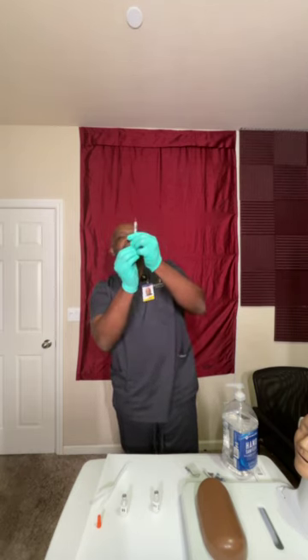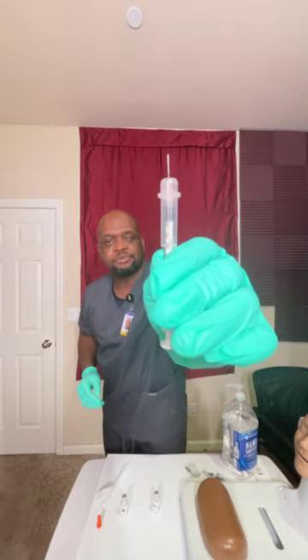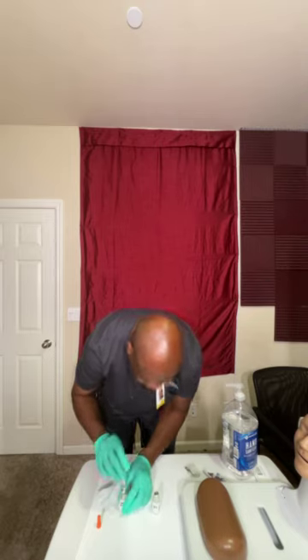Then from there, I will actually pull in 4 units. 4 units of air this time, right? 4 units. And I'm going to show her 4 units of air. Good. We're going to check against the medication administration records, 4 units of air. Now I'm going to also show you 4 units of air. Good. Now, this time I'm going to inject 4 units of air. Now I'm going to invert, flip the bottle.